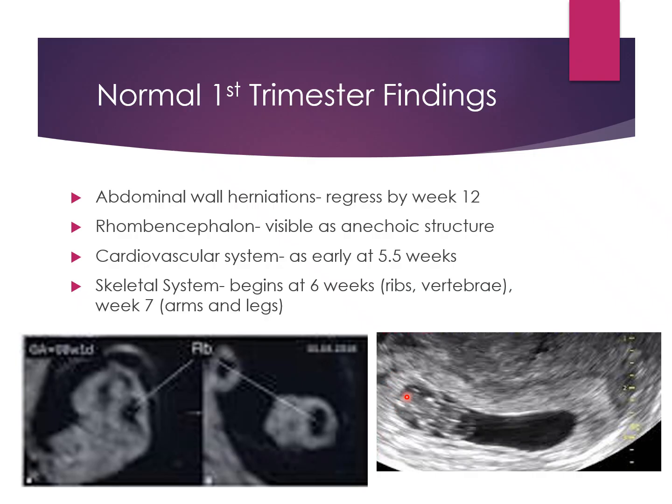And they just put a cute little Santa hat on the baby and call it a day. But they don't realize that they have just put a Santa hat on their baby's butt, because the rhombencephalon is right here, which means this is baby's head. This is not baby's head. This is baby's butt. So head, brain, rhombencephalon.